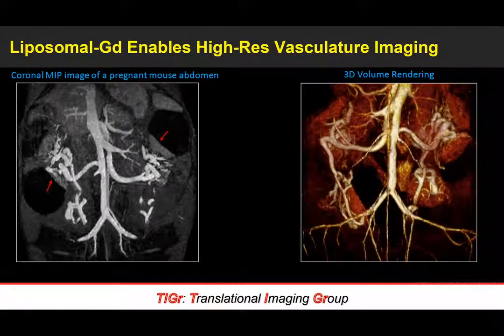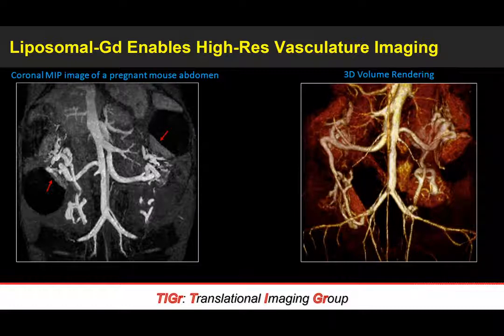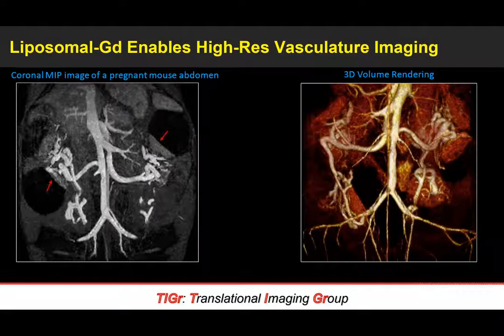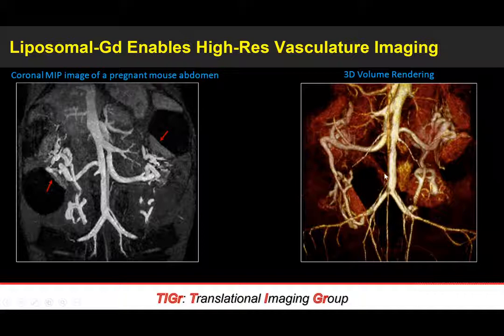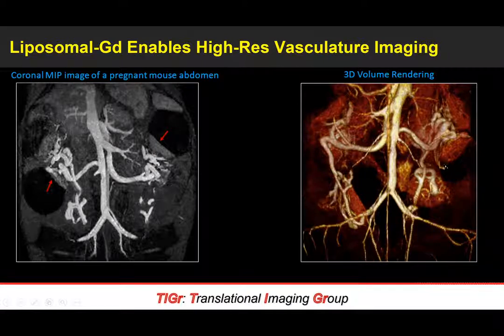To look at different vasculature patterns, here I'm showing a coronal MIP image — a projection of the different slices in the coronal plane for these MR images. You can appreciate just how much signal enhancement we have within the vasculature at one Tesla using these permanent magnets, with pretty high signal quality and uniform signal enhancement in vascular compartments like the IVC and different draining vessels. Note how the signal enhancement is much higher in the IVC versus other target organs like the placenta.